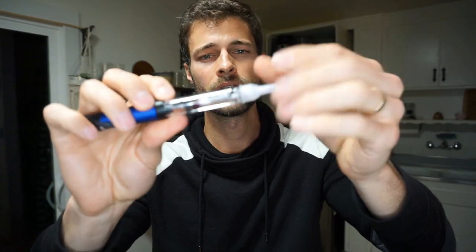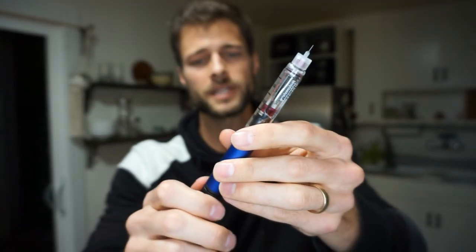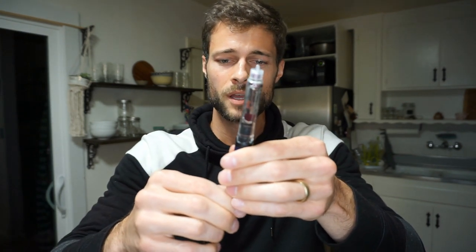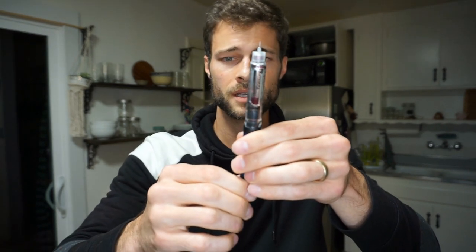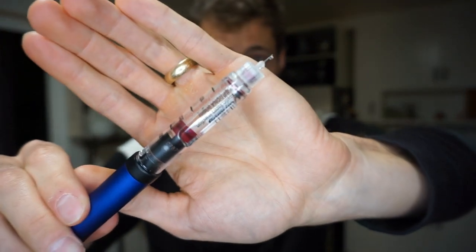Now we're gonna grab a fresh needle, stick that on the end, and remove the safety cap so we have an actual needle. I'm going to dose this out one or two units at a time and push it through until I see insulin. What we're doing is connecting the plunger to the actual cartridge. I'll do two units at a time — still got space, two more, still got space — until we see insulin drops. There we go — you can see insulin drops right there. That is now primed, you are good to go.